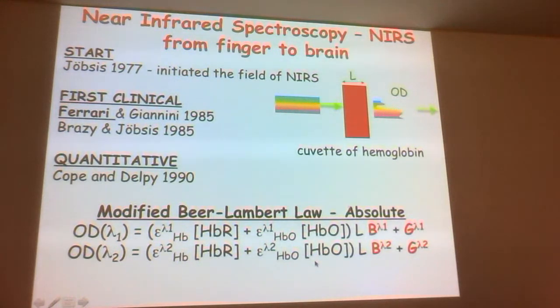The challenge with near-infrared spectroscopy, though, is that tissue scatters light, right? So if we have a source here and a detector there, while the net distance may be 1 centimeter, the total distance that light actually travels is dispersed, and on average is going to be 10 centimeters. There are some photons that will travel only a centimeter or two, but many more that travel several centimeters because the scattering is happening on such a short length scale, and the photons are undergoing a random walk.